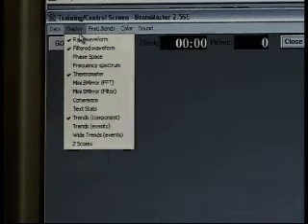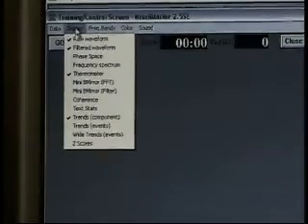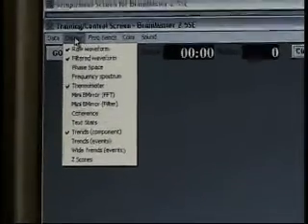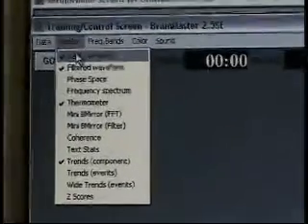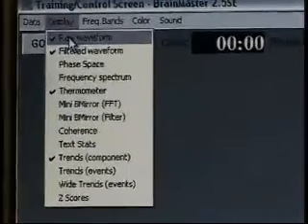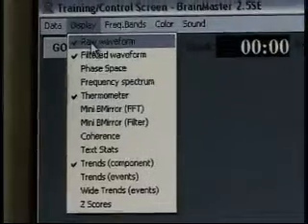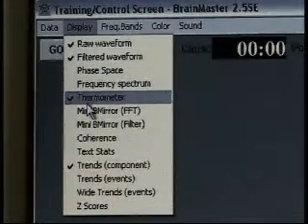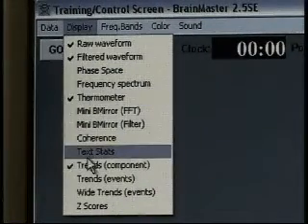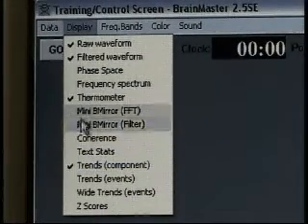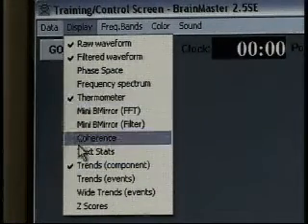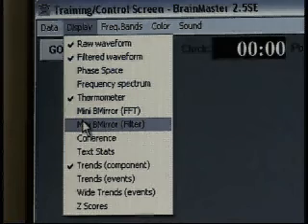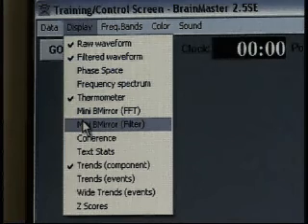As I go to Display, you'll notice that — remember we chose raw waveform, filter waveform, thermometer, and trends. Again, this is where I can turn on or off panels from the training screen.